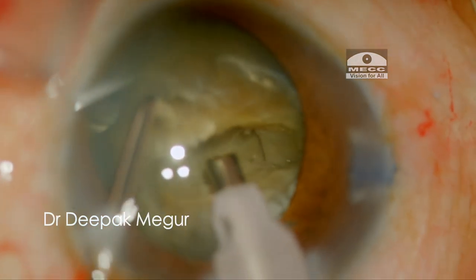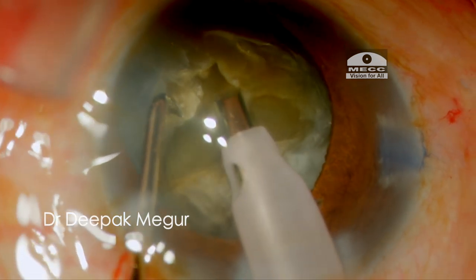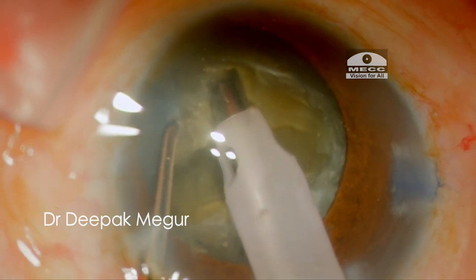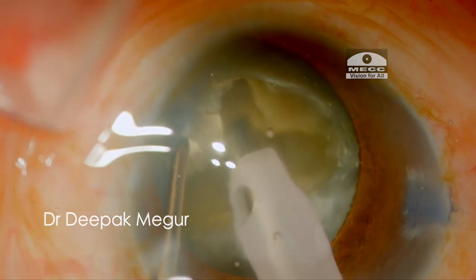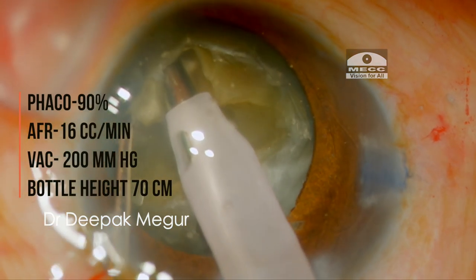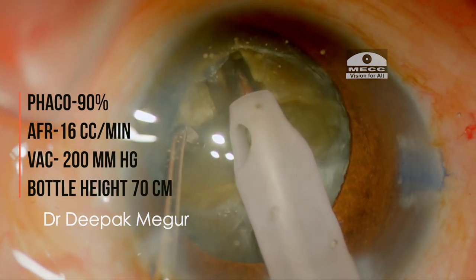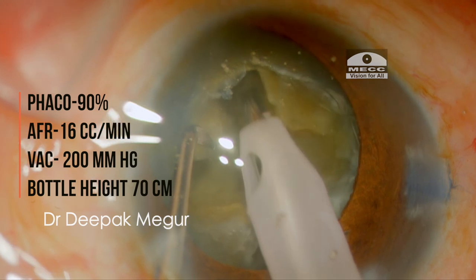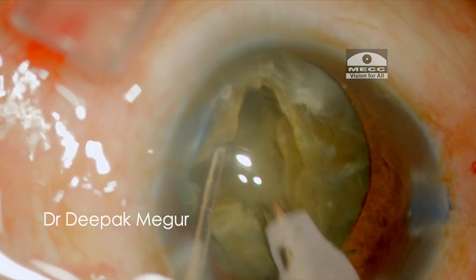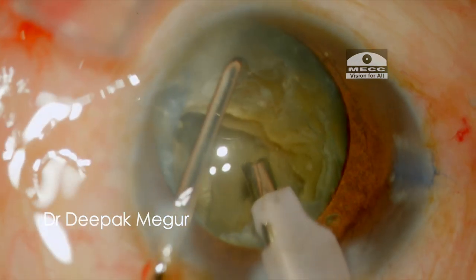During sculpting, I try to stabilize the nucleus with my second instrument. The sculpting is performed in a controlled manner, and an important principle to understand is that the nucleus should never be pushed. Instead, the nucleus material should be gently shaved off without causing any undue stress on the zonules. It's important to have an appropriate phaco power so that the tip cuts through this dense nucleus effortlessly.